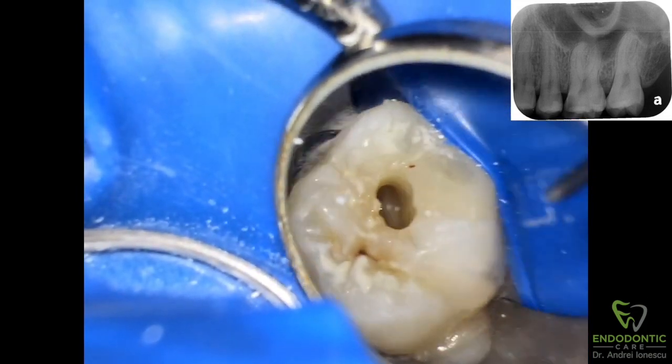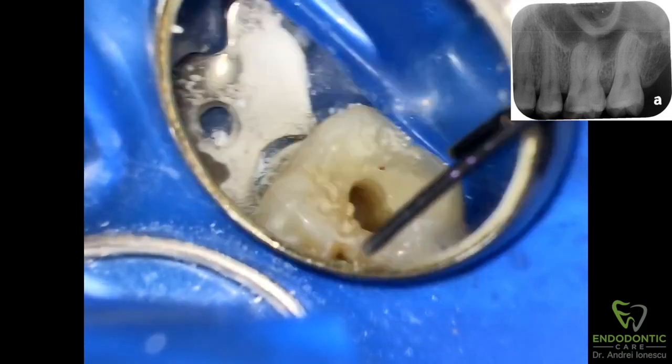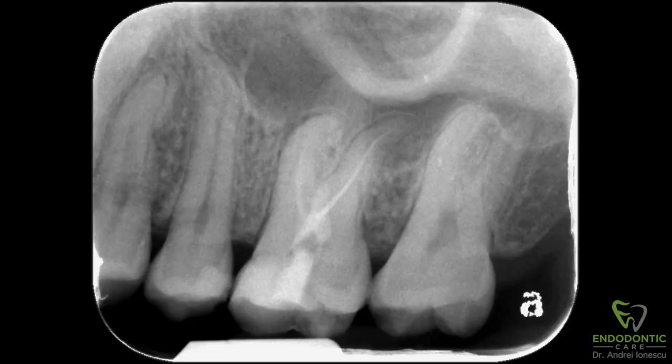And there it is — the moment that the bead of sweat forms on the back of your neck as you see the file come out shorter. I felt like this was a good time to stop, close up, put calcium hydroxide, and take an x-ray, and come up with a plan on how I'm going to be removing this file and completing the case.